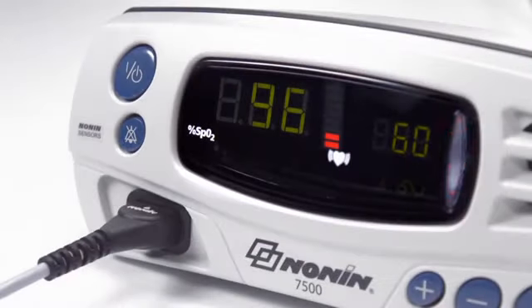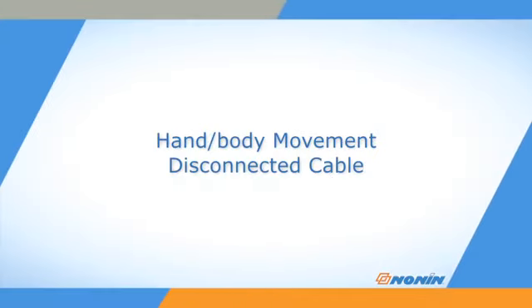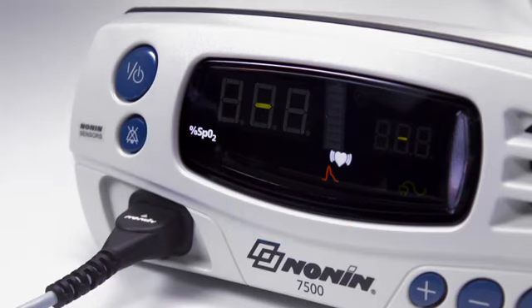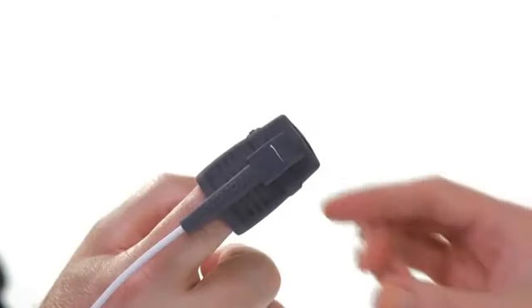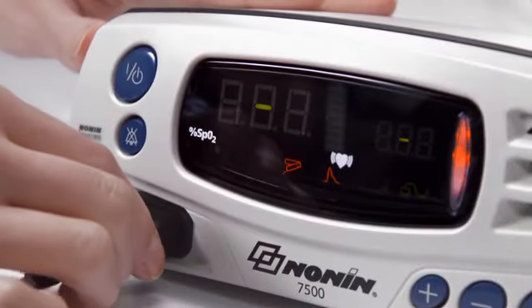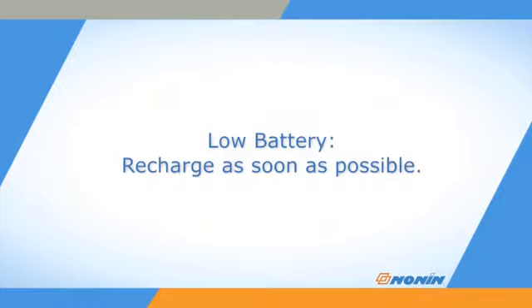It's a good idea to check pulse signal quality at startup and adjust the sensor for a stronger reading if necessary. Signal loss from the sensor is possible with hand or body movement or disconnection of the cable. A sensor icon will appear on the screen and the oximeter will alarm if this occurs. Signal can also be reduced by body position or cold conditions, which may reduce blood flow. Check and correct the position of the sensor if it has moved, and recheck the sensor connection to the oximeter. The low battery indicator will blink when the battery is getting low and stay on continuously when critically low. Recharge the battery as soon as possible.